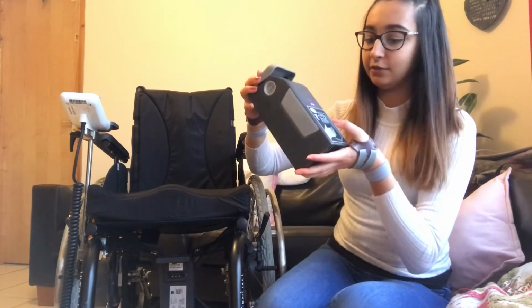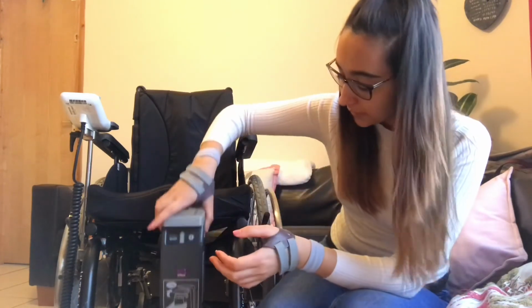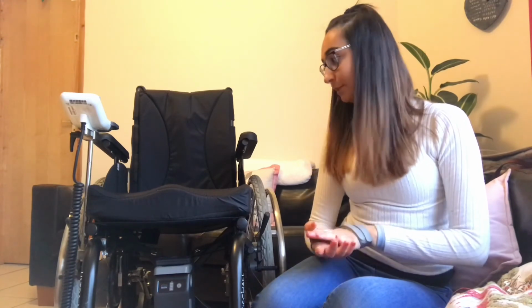The battery itself isn't very heavy because I can lift it, but the wheelchair and the wheels and everything are quite heavy, so that could be something to think about. And I think that's everything I had to say about it. So if you have any questions, please let me know.